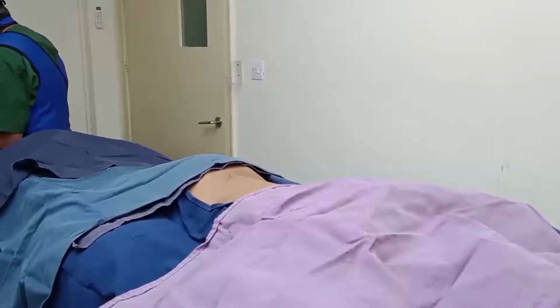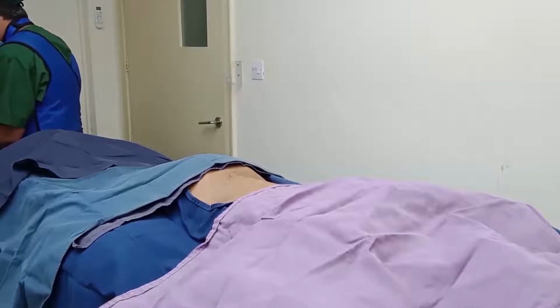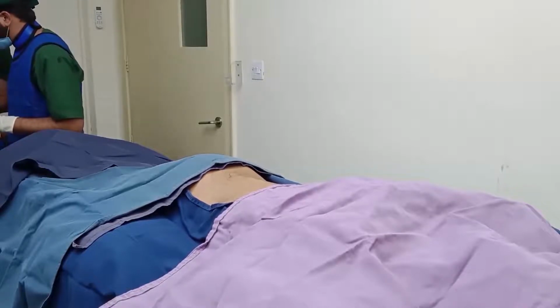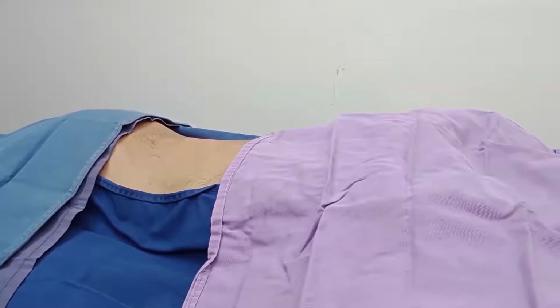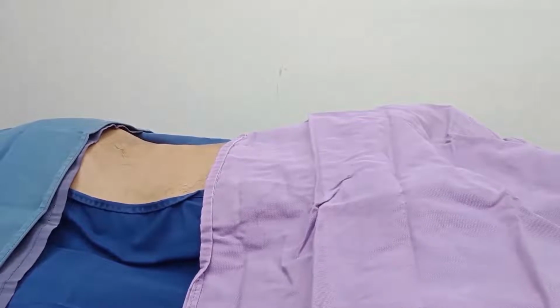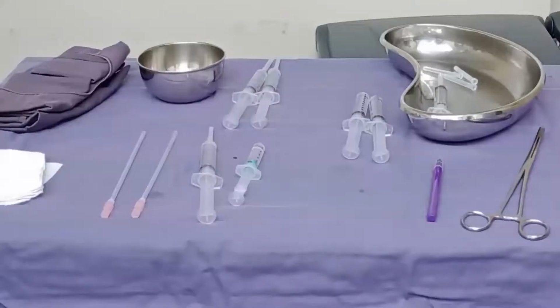For this procedure the patient has to be positioned prone to increase the flexion of the thoracolumbar spine. The procedure is done in sterile condition with 2% chlorhexidine skin preparation done twice, along with the sterile drapes along the site of the procedure. The sterile trolley for this procedure is prepared.